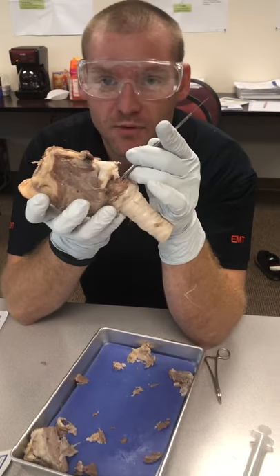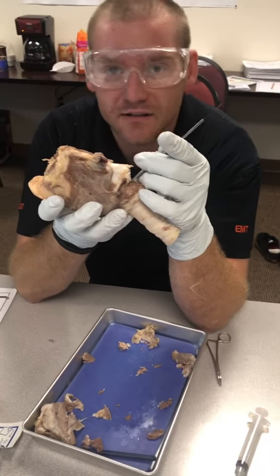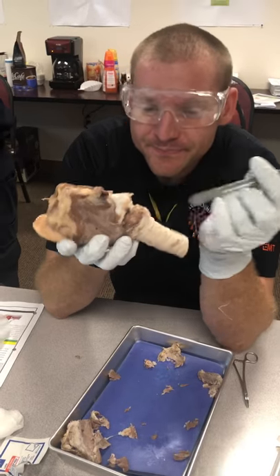Upon palpating that, we were able to introduce our curved introducer and then pass our endotracheal tube.